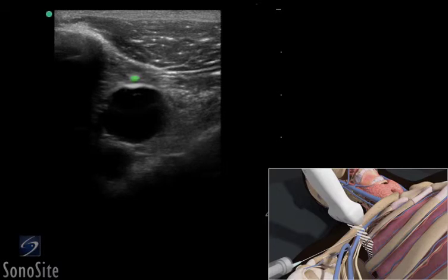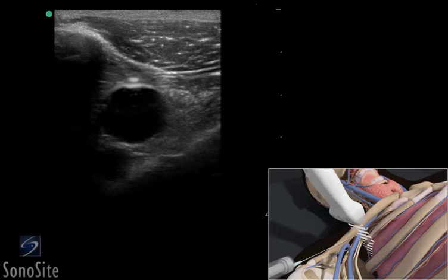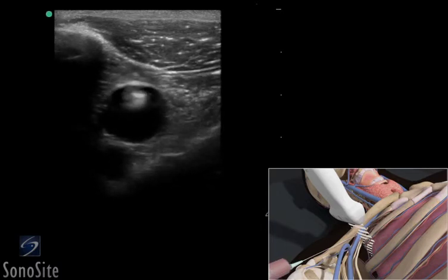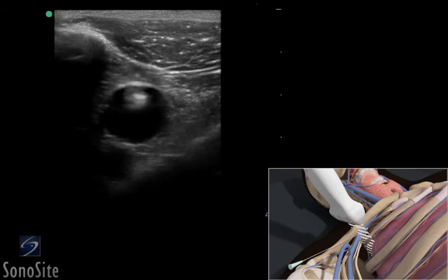When the needle tip appears, the transducer should be advanced a short distance distally to follow the tip of the needle trajectory and stay in advance of the needle entry. The needle is slowly advanced under direct ultrasound visualization until the tip is seen to puncture the subclavian vein. The probe should be moved slightly proximally and distally to confirm that the needle tip lies in the mid portion of the vein.